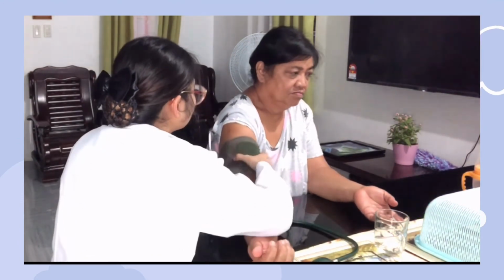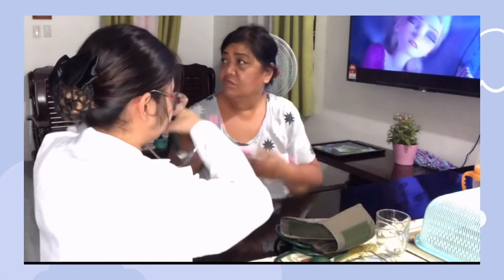When the device has determined the blood pressure reading, note the digital results. Then remove the cuff. And lastly, wipe the cuff with an appropriate disinfectant.